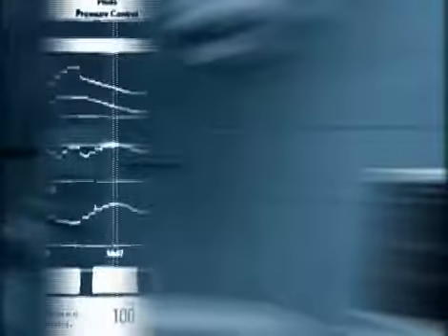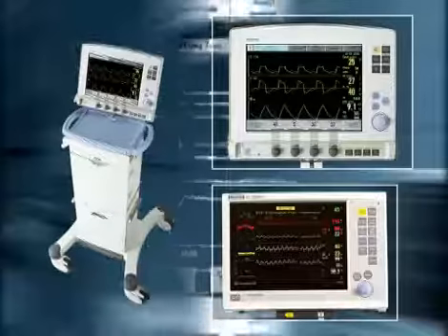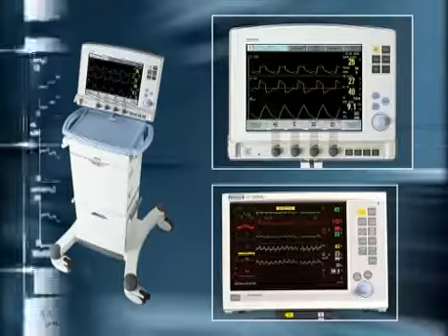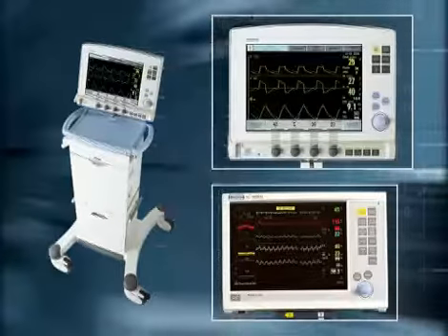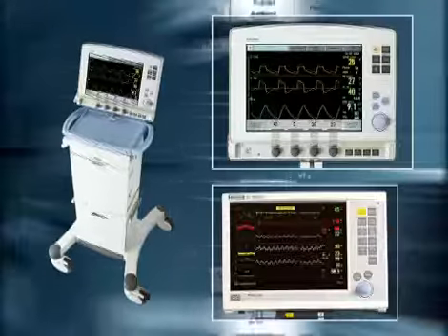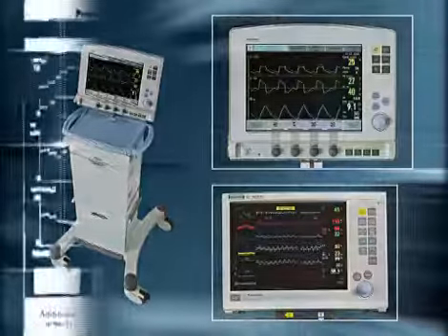The Open Lung tool will be used to monitor a recruitment sequence in an experimental pig model. Acute lung injury is induced by surfactant depletion after lung lavage with normal saline, producing a moderately injured lung. Ventilation is provided by a Siemens Servo-I ventilator, with the Open Lung tool option in combination with a Siemens Infinity SC9000XL monitor. This provides full respiratory and hemodynamic monitoring, including invasive systemic arterial pressure and pulmonary arterial pressure.